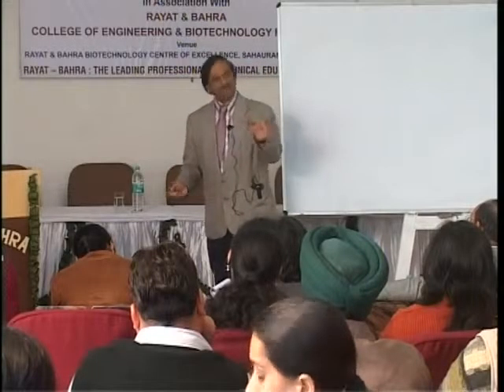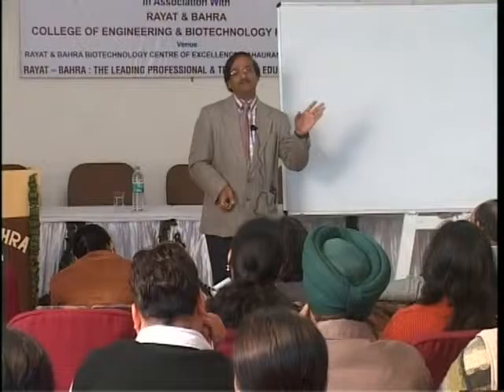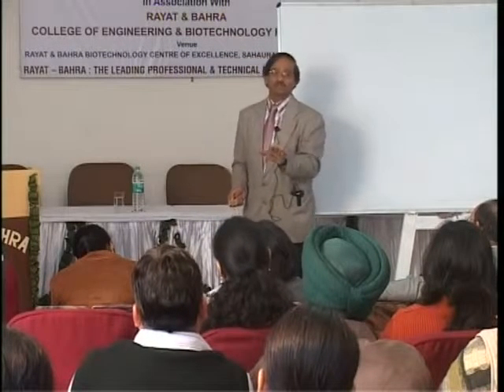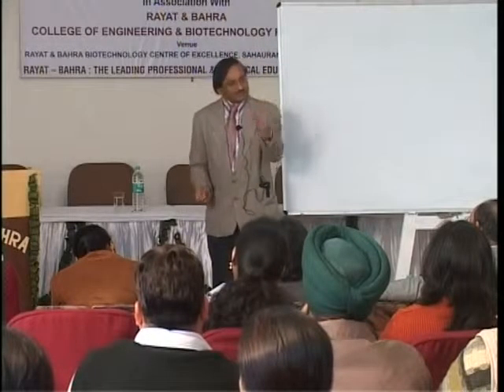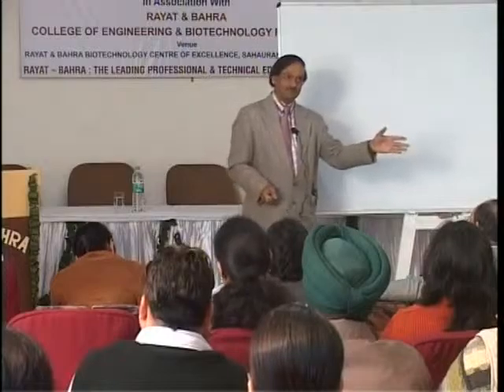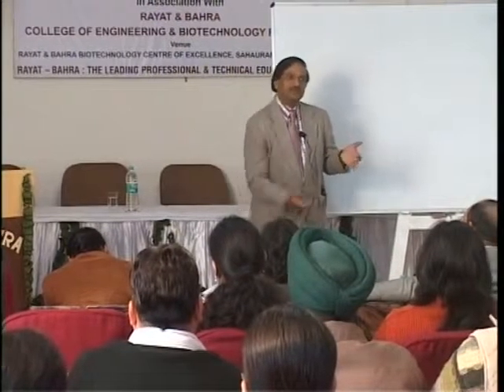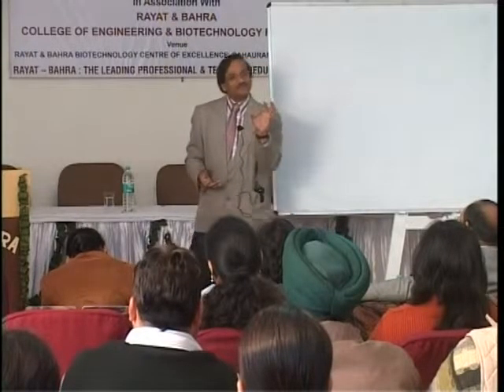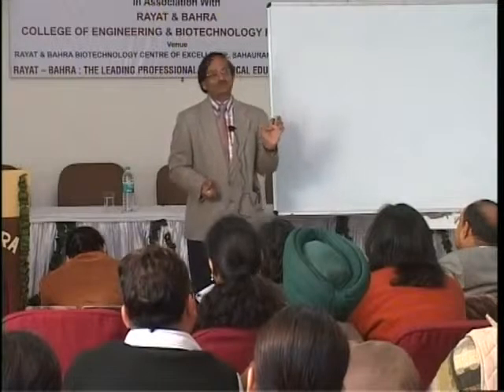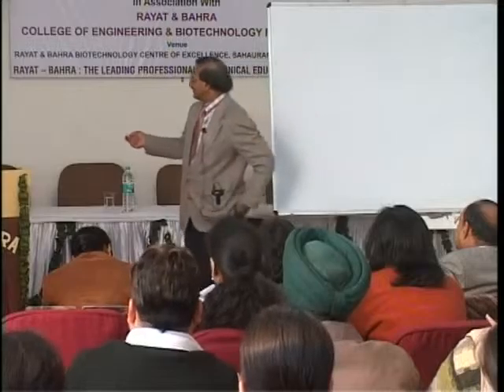And of course, as you know, PET and SPECT give functional and physiological information. Similarly, MR can also give functional information. A functional MR or MR spectroscopy can give functional, physiological or chemical level information, so you can supplement the PET data with functional imaging data. So this is a very strong modality in terms of fusion, both in resolution as well as sensitivity. Next.